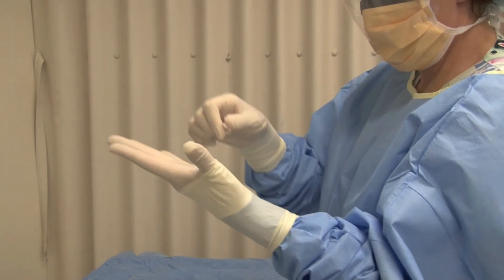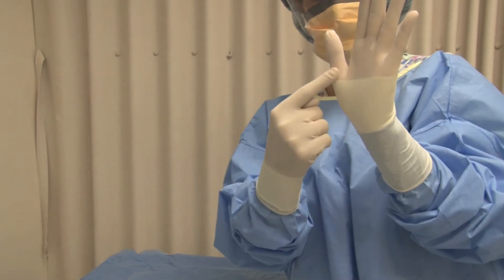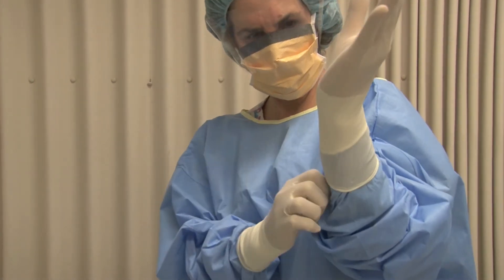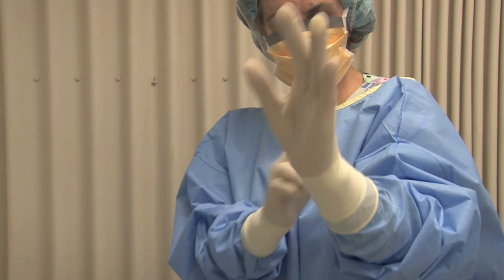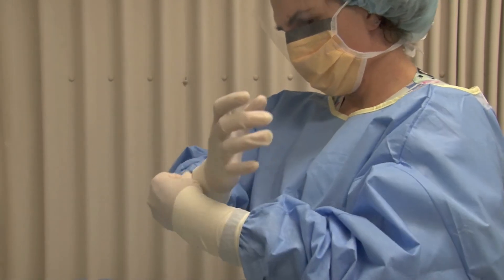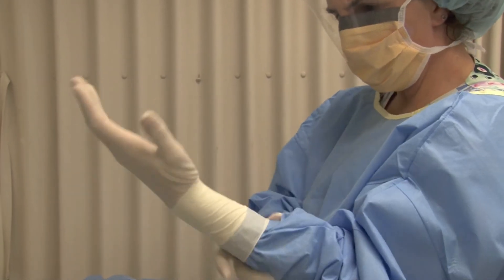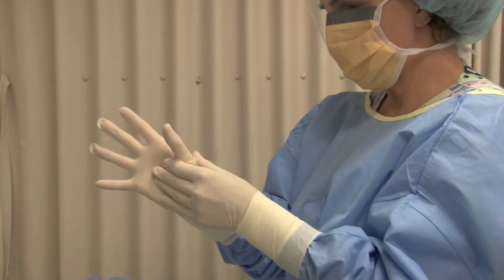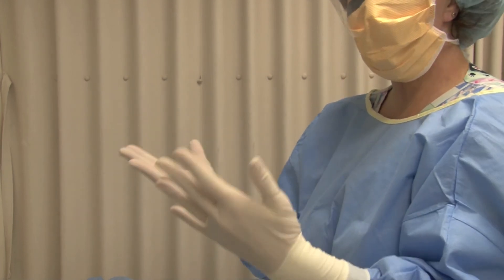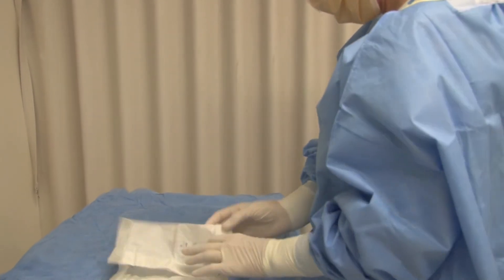You can see I've got two fingers in one glove space — grab those two and give them a little pull and they drop into place. My thumb isn't in place yet — same principle, pull the thumb and put your thumb up into the space. Then carefully pull the cuff down. The cuff jumped out from under the glove, so just pull that down, making sure this is your under-glove but it sits fairly flat on your hands. If there are any creases in your hand, we're about to put a smaller glove over the top, and any creases become pressure points — the same as for any patient with a dressing.